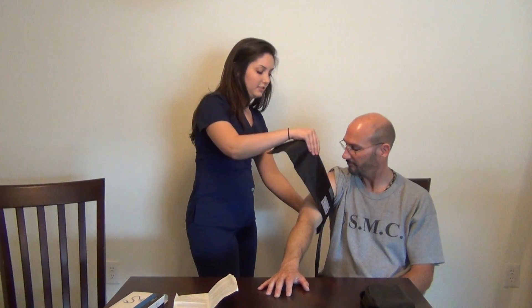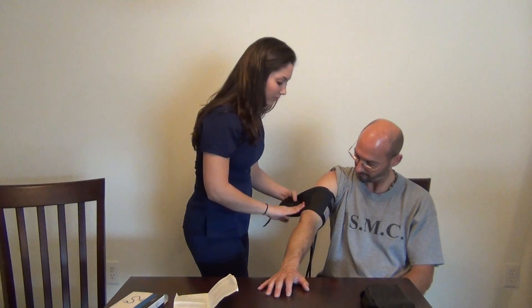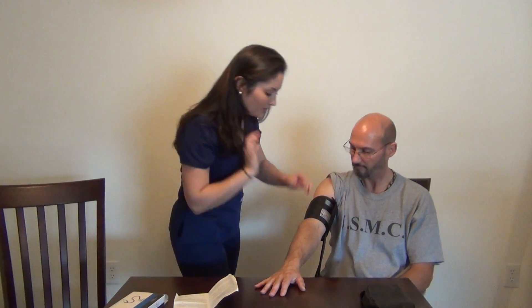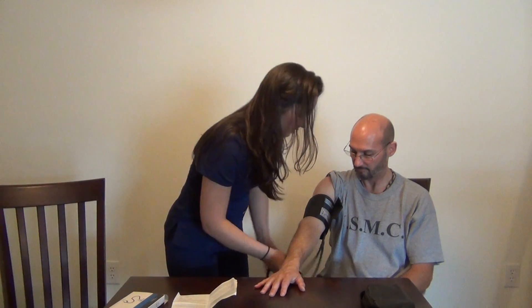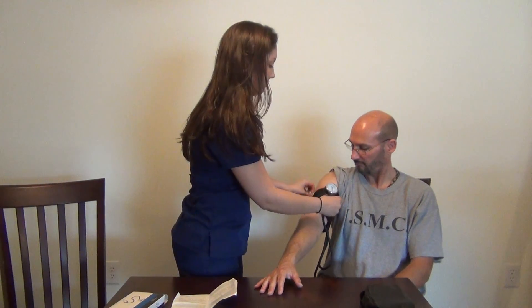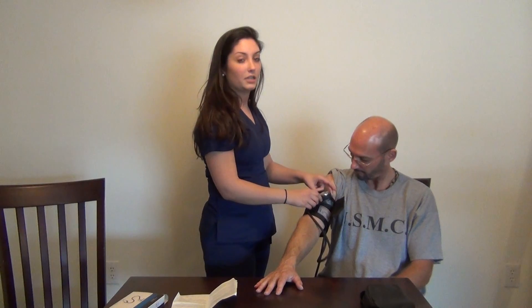You want to fasten it so that it's tight enough that it doesn't fall off, but not too tight — you don't want to hurt your patient. Once it's lined up, check it again to make sure. Then take the meter part, which has a little hook on the back, and hook it onto the little gray flap right here so that you can easily view the meter while you're taking the blood pressure.